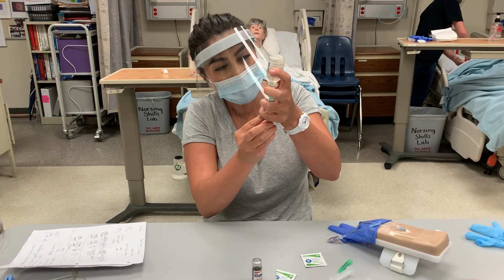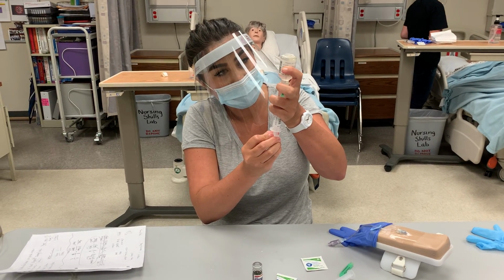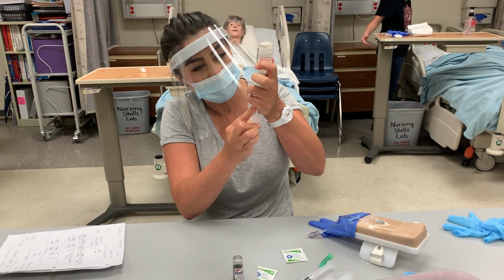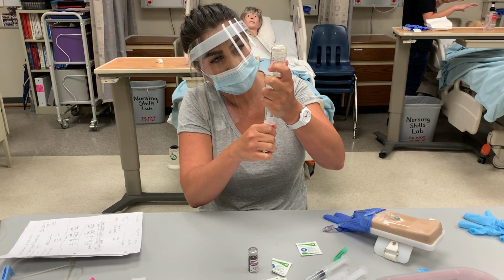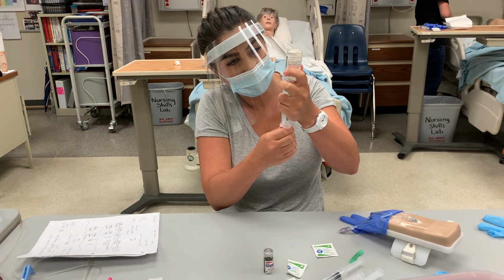to the 6 mLs, making sure not to overdraw or push any medicine back into the saline. It's really hard. That's a lot of resistance.